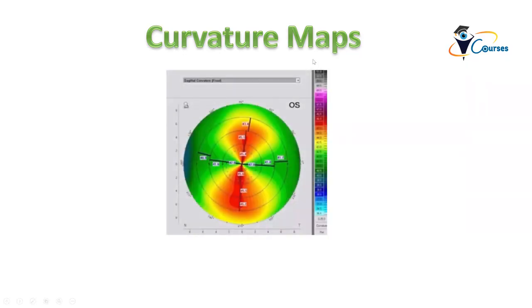developing or having keratoconus? For the curvature map, the normal curvature map represents how much every point of the cornea is curved. So if it is very curved, it will be represented by hot colors like red and orange. If it is less curved, it will be represented by cold colors like green and blue. So for this, what we can see is an increased curvature in this meridian, taking the form of what's called the bow tie.